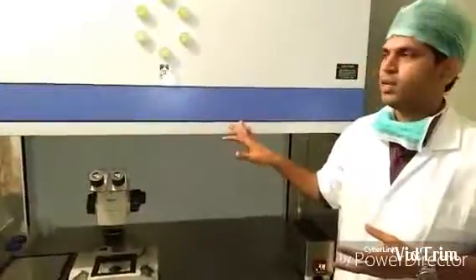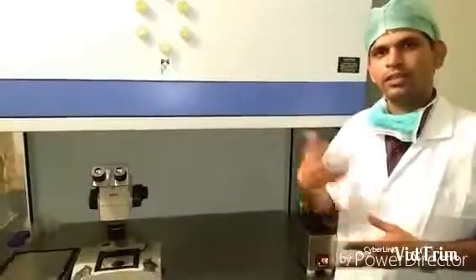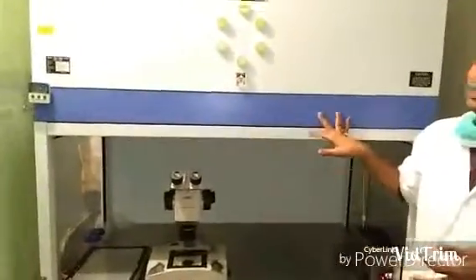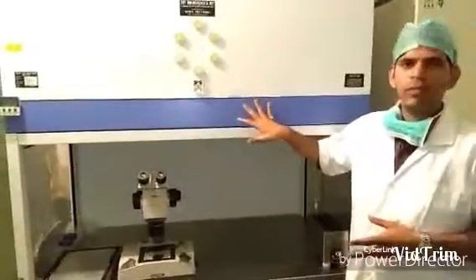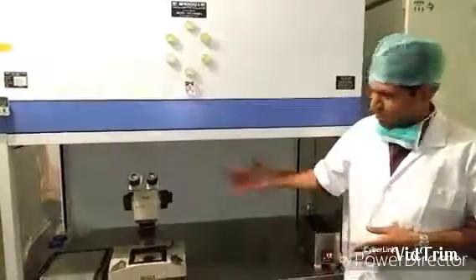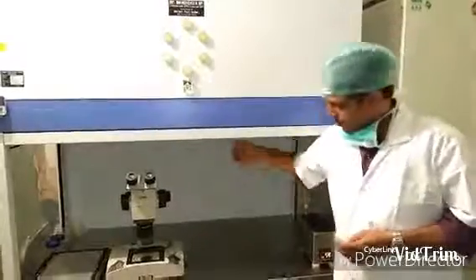There are two types of laminar flow cabinets: vertical laminar flow and horizontal laminar flow. This one here is a vertical laminar flow cabinet, where the HEPA filter and fan are located at the top. In a horizontal laminar flow cabinet, the fan and HEPA filter are positioned at the back of the cabinet.